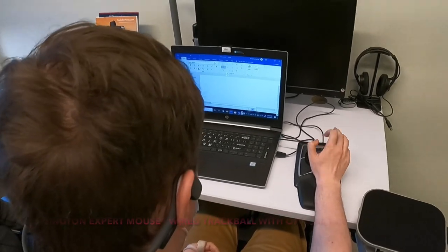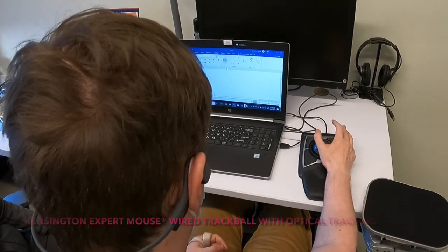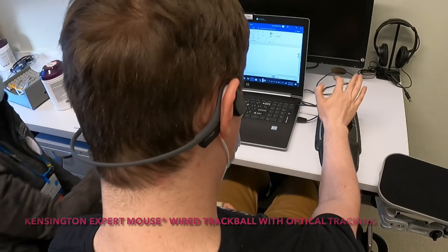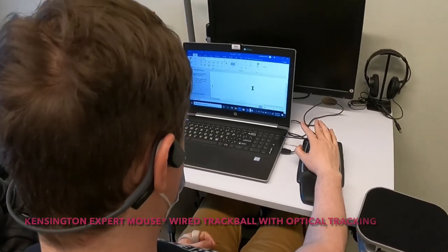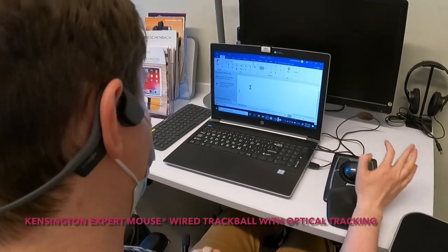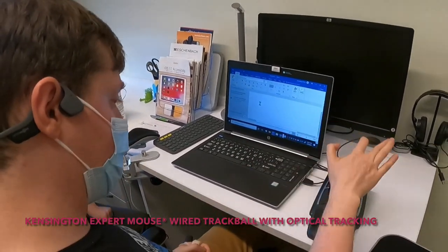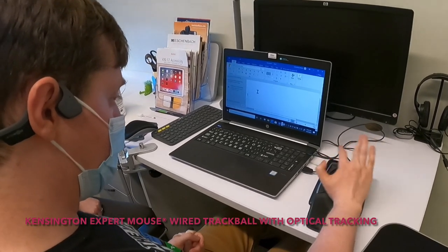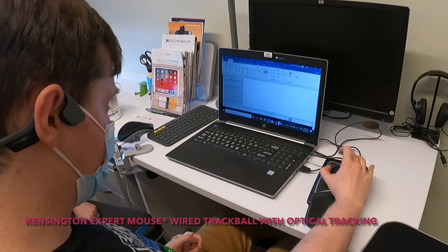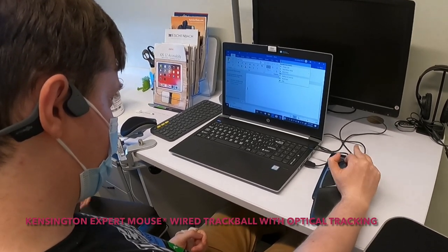Can you roll the ball with your thumb, maybe? You can roll it with any part that works for you. A lot of my patients who are using a trackball have no finger movement at all, and they use their wrist or the heel of their hand.